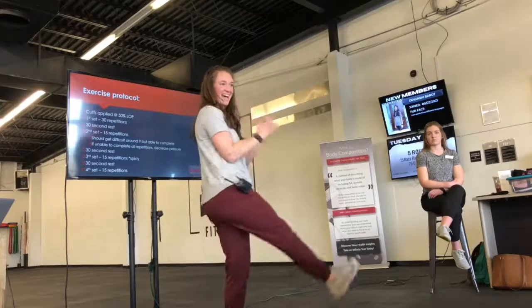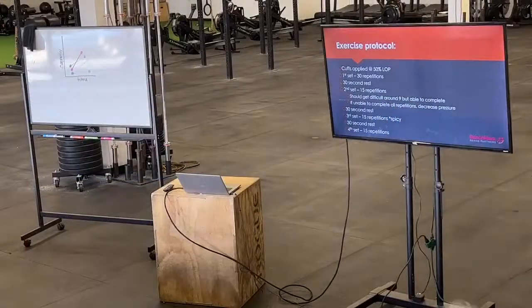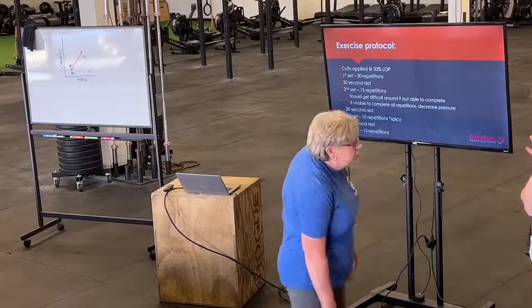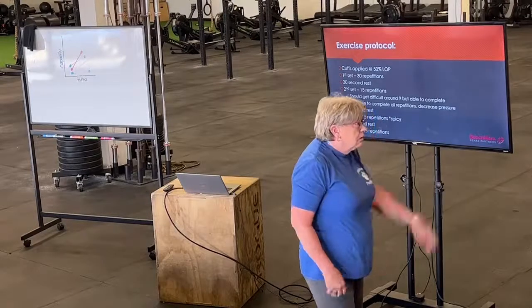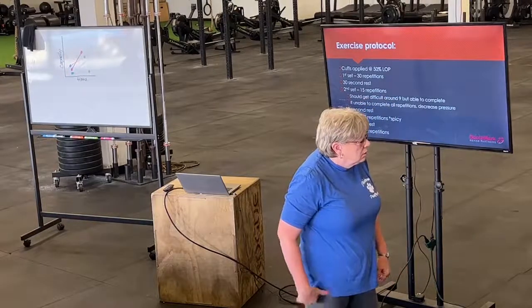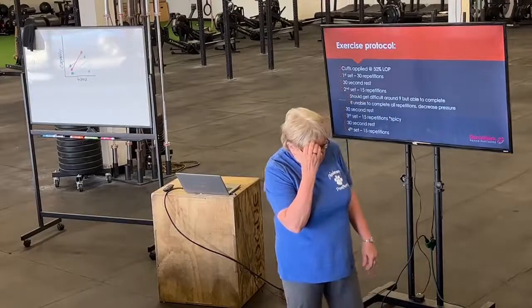You want to try? Okay. Go, Deb. What do you want to try? I have a spot on my leg when I had a hysterectomy, they hit the nerve or something. So I have a spot that's kind of deadened and it's spreading. Oh, why don't we do this then? We'll just keep it simple. We'll put it on your hip. And then I'll have you sit on the edge of the box and we can just do some leg raises. Okay, thank you, Audrey.